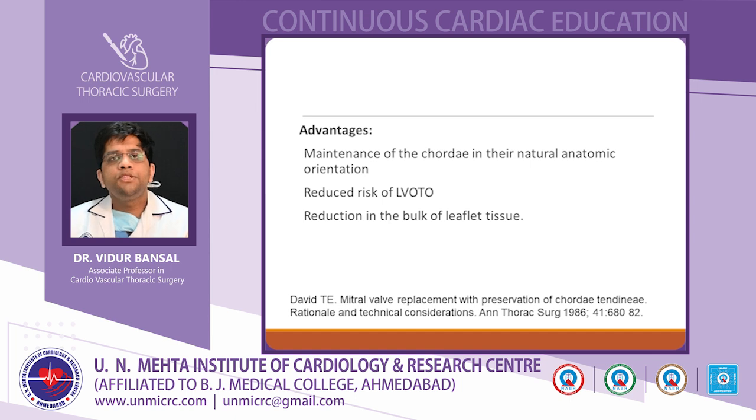So, the advantages of this procedure are that there is maintenance of the chordae in the natural anatomical orientation, there is a reduced risk of left ventricular outflow tract obstruction, and there is a reduction in the bulk of the leaflet tissue, since we have excised that triangular segment of the AML.